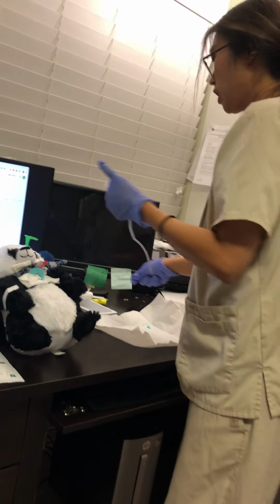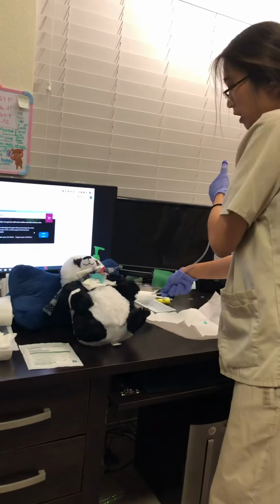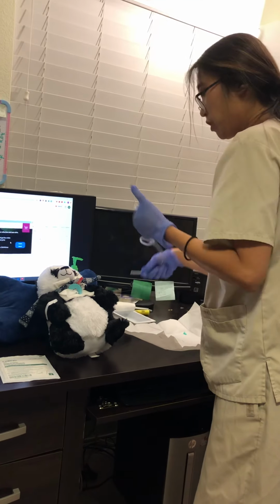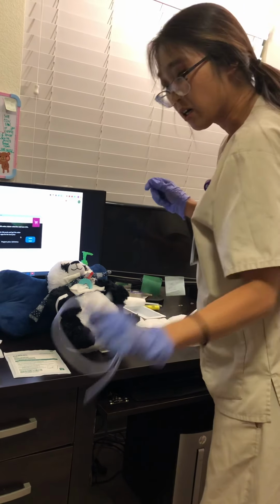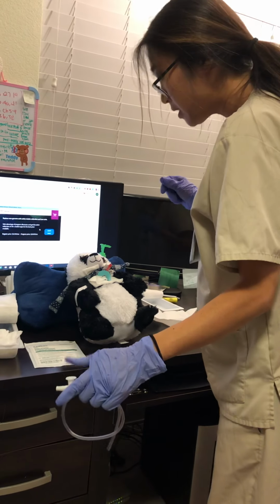Before you suction, you can also check the suction from here and make sure it works. In this case, it works. So then after that, I would discard my equipment.